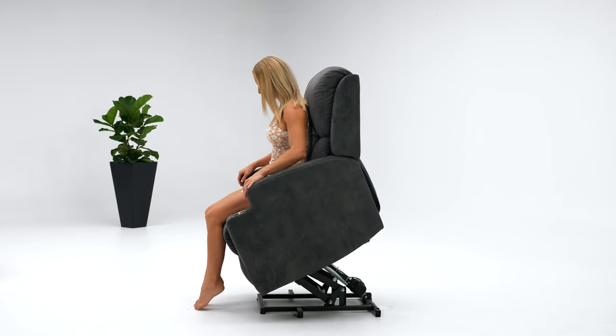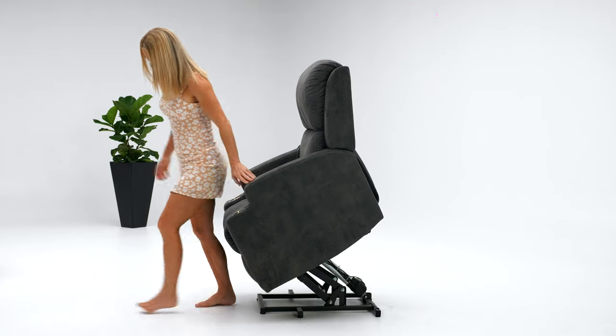Our therapeutic lift recliner chair has a comprehensive two-year warranty on all parts. You can call us on 1300 975 337 or chat with one of our consultants on our website chat function. We're more than happy to provide all the information on features and functions, and also explain how you can own your luxury lift recliner chair with zero deposit and from just $22 on our interest-free payment plan.